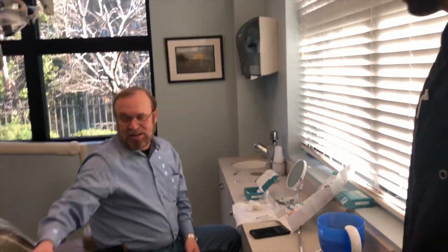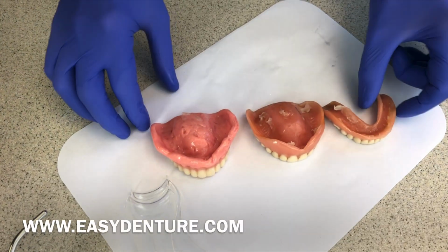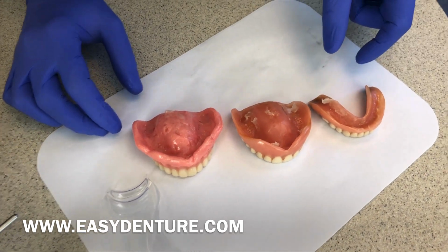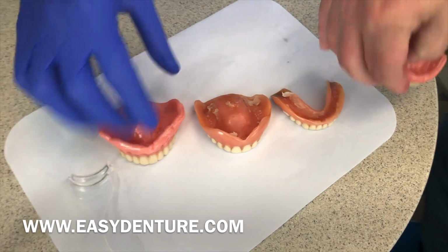If I don't glue those in every day, in fact, the bottoms I have to glue in twice a day. And right now you have zero glue here. No, nothing. And the retention that you feel? No, they're good right now. All right, excellent. If you want to pull out the lowers too, I could kind of show how I captured the extensions.